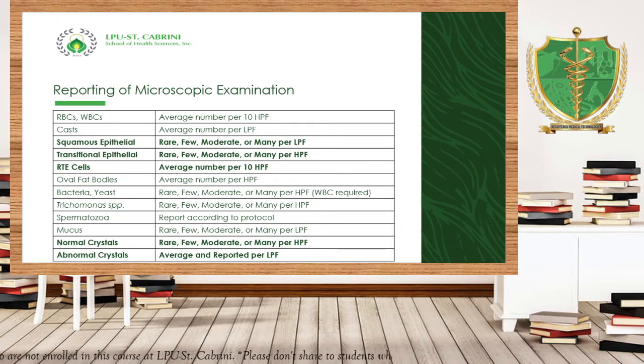I don't know if I was able to tell you this story. Forgive me if I am telling you a story, but it is relatable to the topic that we have. I still remember when I was working in the laboratory, a nurse called asking why the urine does not contain bacteria, because it was marked 0 in the report generated using the automated urine analyzer.